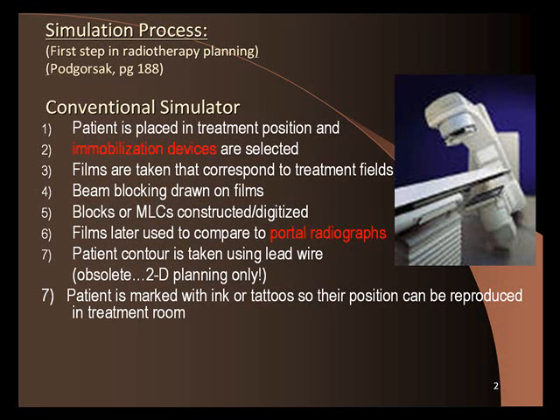But anyway, in terms of the simulation process, what's the purpose of this process? And where does it fall into the radiotherapy process? Do you guys have an idea where the simulation process falls in? Like what step? There's a lot of steps. The doctor first makes a diagnosis, then the patient comes in. It's one of the first steps, isn't it? So the doctor sees the patient and says, well, you're a candidate for radiation therapy. These are our treatment options, and then the patient agrees to get treated. Then right after that, they make an appointment for the simulation.